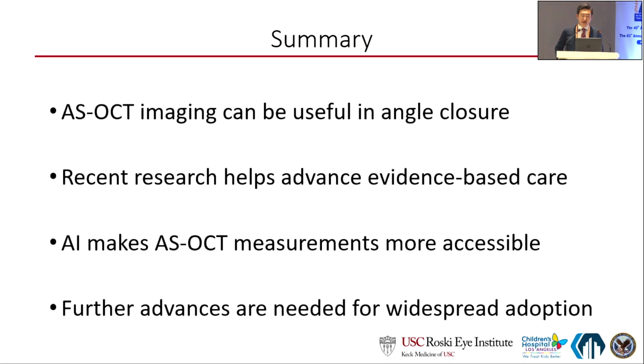So in summary, ASOCT imaging can be very useful for the care of our angle closure patients. Recent research helps advance evidence-based care, and AI makes this technology and ASOCT measurements more accessible for busy clinicians. However, we still need further advances and research before we can widely adopt this technology for the care of our angle closure patients. So thank you very much.